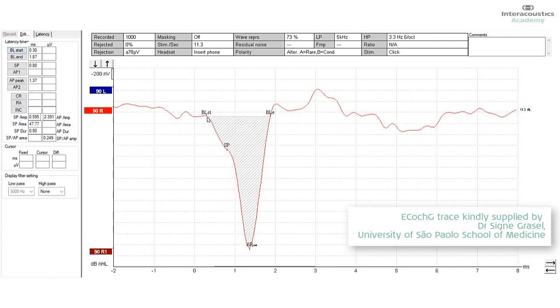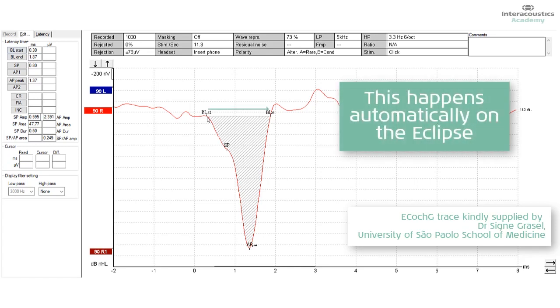And then we take our cursor and we extend it across in a horizontal fashion until it reaches the next portion of the waveform where the amplitude of that particular spot is exactly the same as the amplitude as the beginning or baseline start spot.